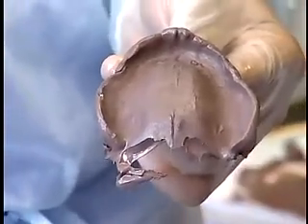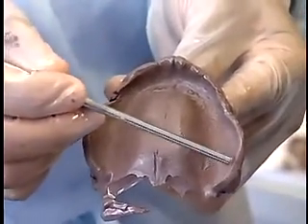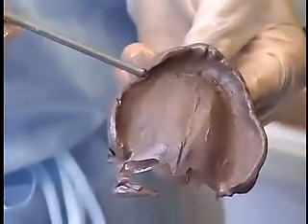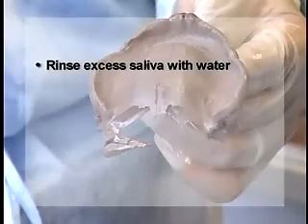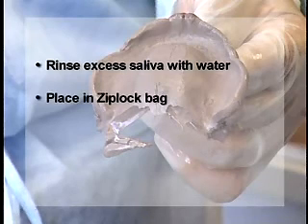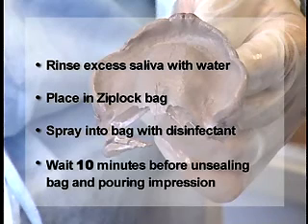Inspect the impression to determine if it's acceptable. Disinfect the impression by rinsing excess saliva with water. Place the impression in a Ziploc bag and spray it with the current approved disinfectant. Wait 10 minutes before unsealing the bag and pouring the impression.